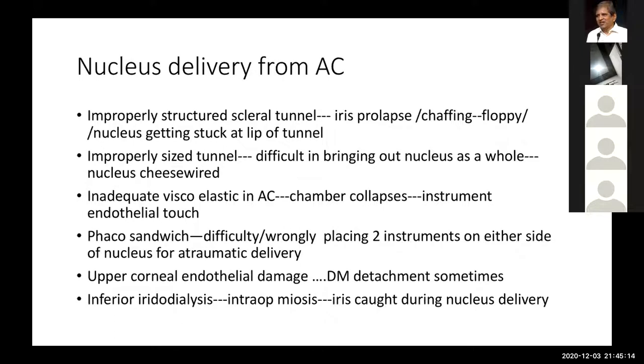Next is, once with difficulty the nucleus is delivered into the anterior chamber, there are a couple of things which I have noticed during the course of our training period here while teaching the postgraduates. A lot of things are there. See, nucleus delivery is one step of cataract surgery. That's what everybody has to understand. Each and every step of cataract surgery is very important. Supposing the scleral tunnel is not properly fashioned, or even capsular access is not done properly, all these things will add to difficulties later on for the subsequent steps.